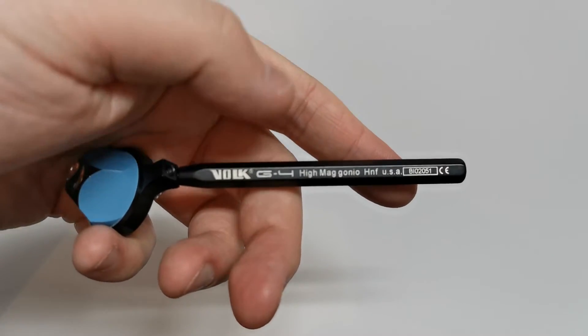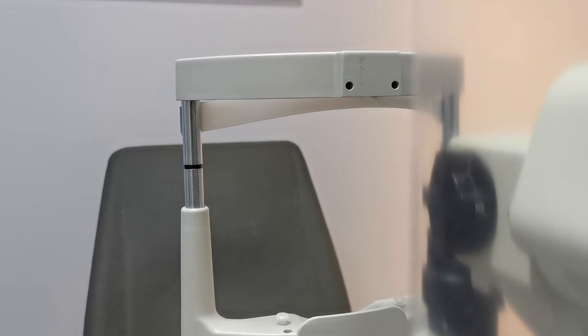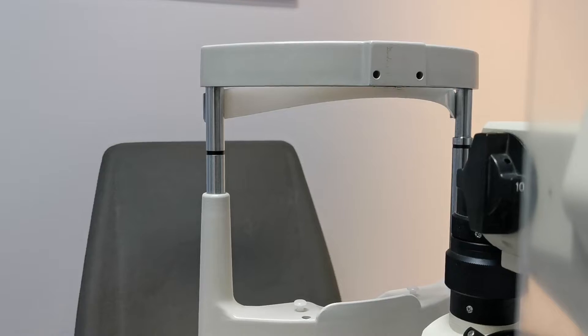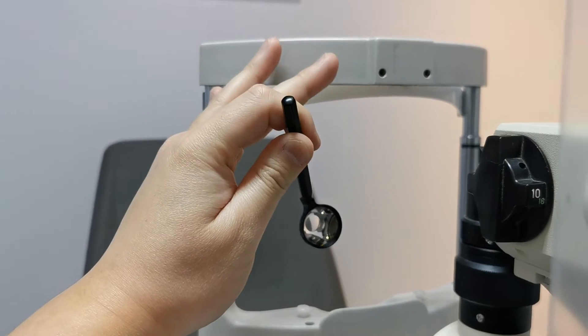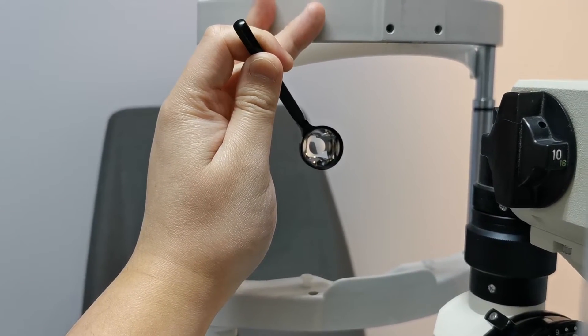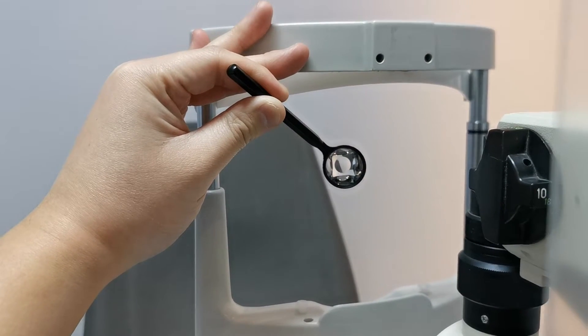In case you're wondering, this is the name of my lens here. Typically, you would hold your gonioscopy lens like you would for fundoscopy. With the handle, I am able to travel what feels to me like a greater distance, and it generally feels a lot more comfortable for me when assessing all four quadrants of the angle.